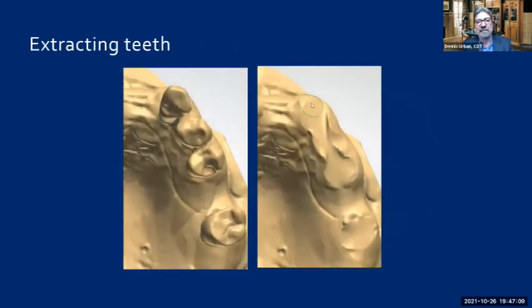I love this for immediate dentures. I lecture a lot about immediate dentures, and I've been very successful with them over the years. For some reason, a lot of technicians and a lot of doctors have a hard time with immediate dentures. I like to contour the bone and tissue the right way so it's comfortable for the patient, and it's going to be easy to insert after the extractions. And this is pretty easy to do here.